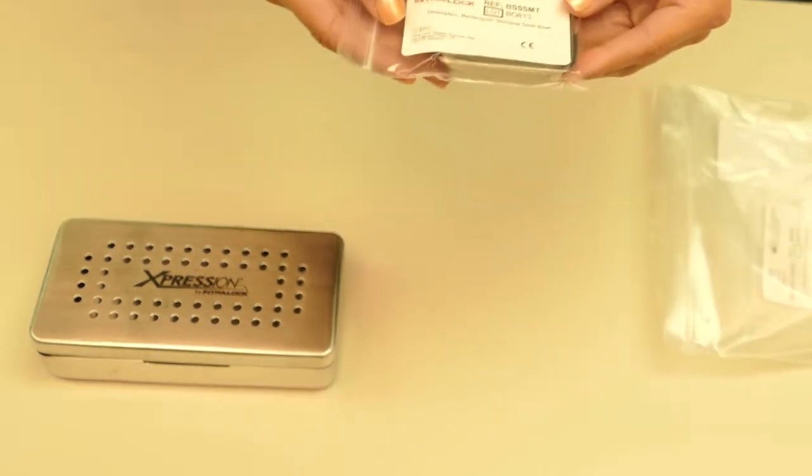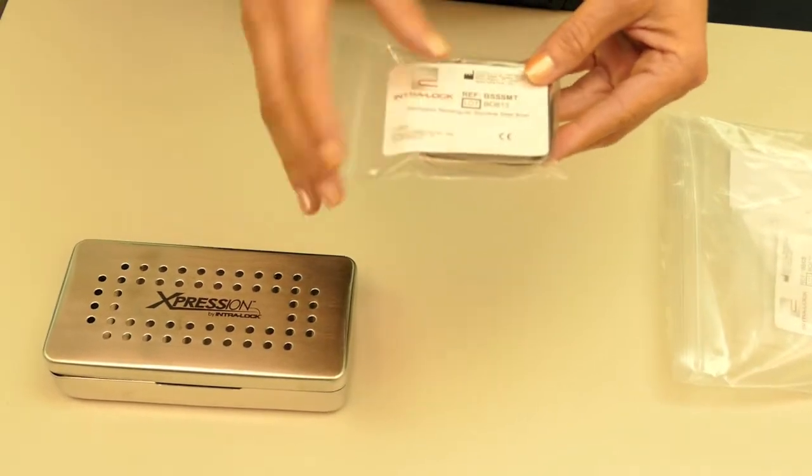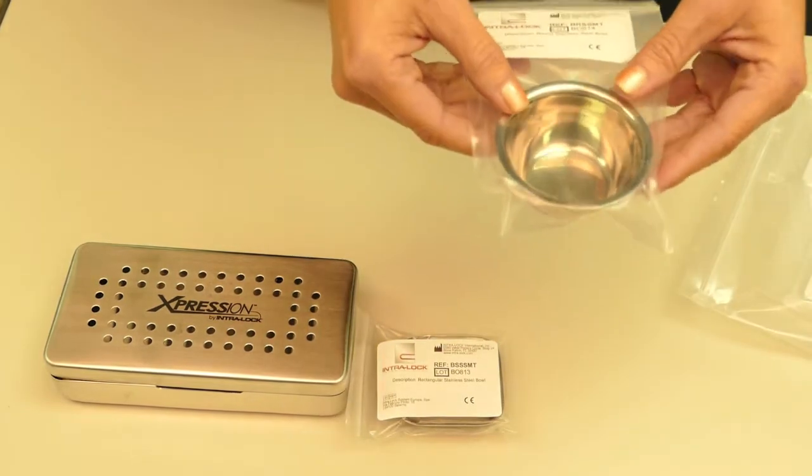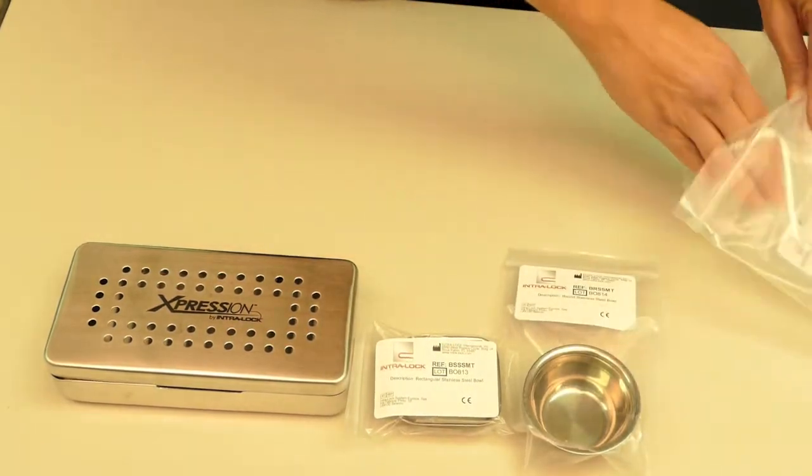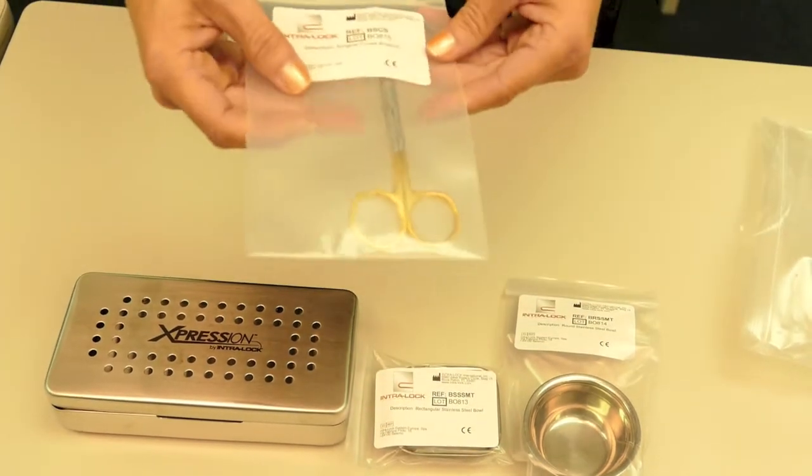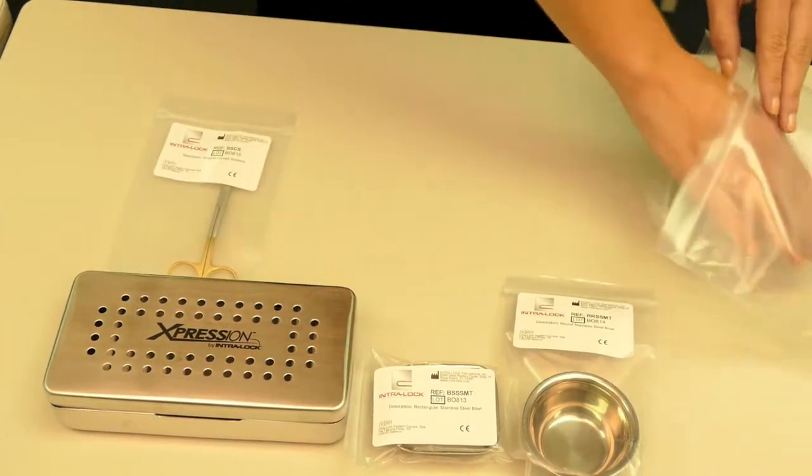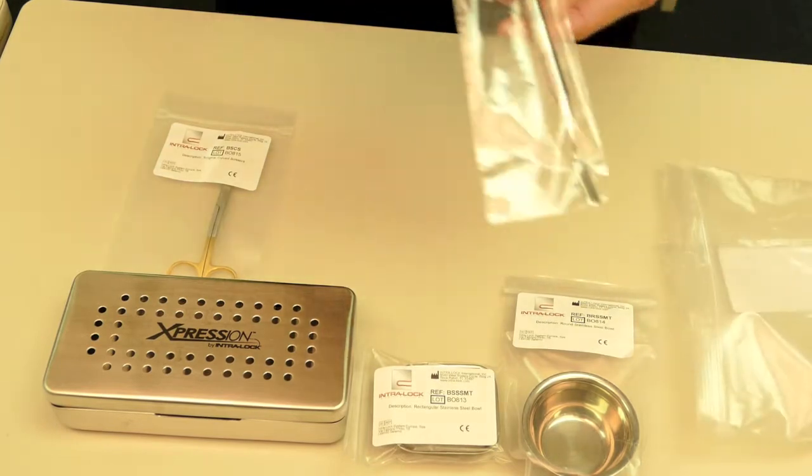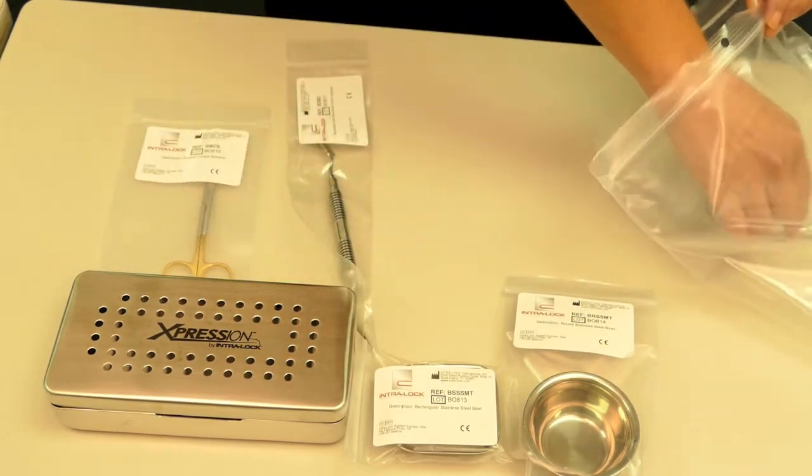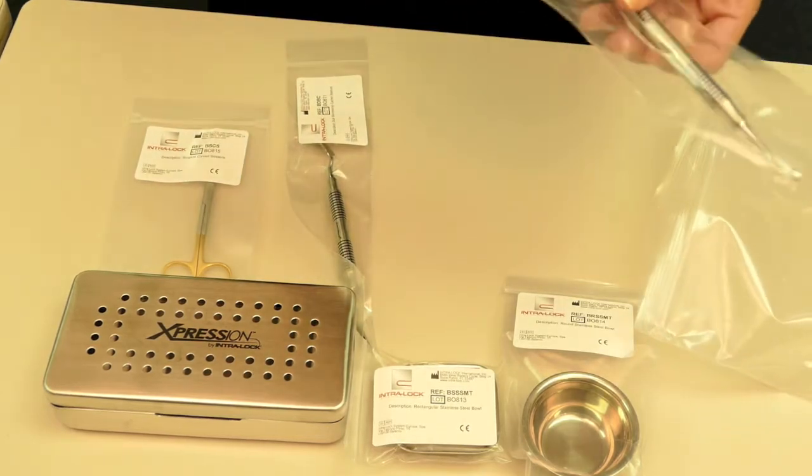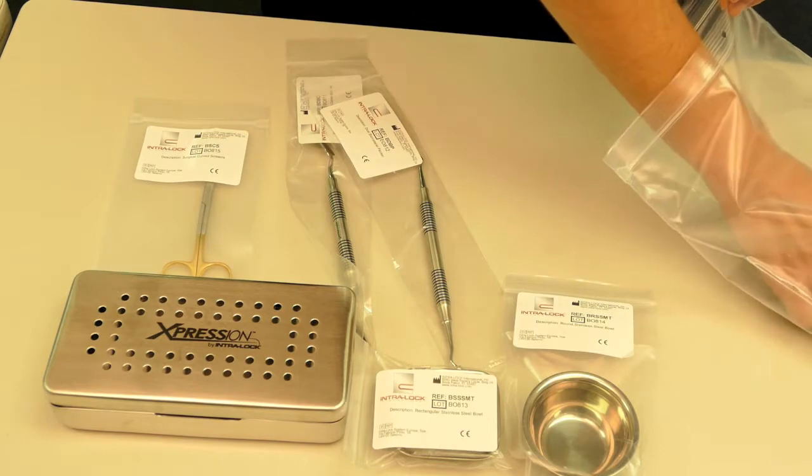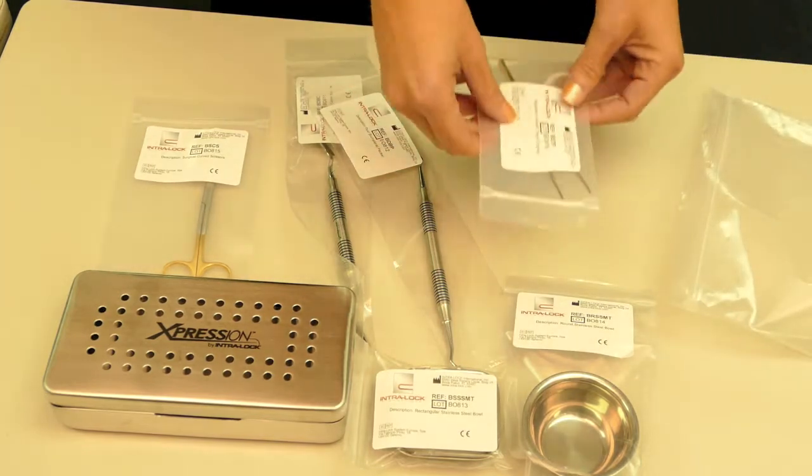Next, you have your rectangular stainless steel bowl, your circular stainless steel bowl, your surgical curved scissors, your dual biomaterial carrier spatula, your dual biomaterial packer, and your surgical tissue forceps.